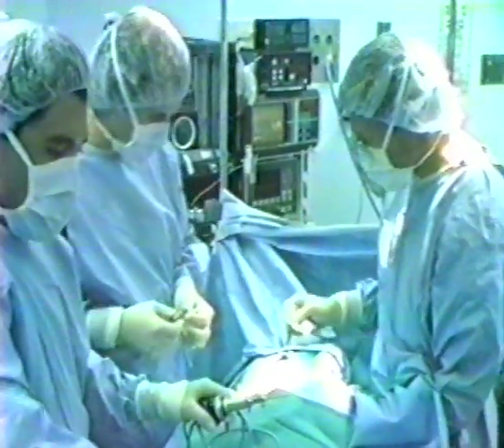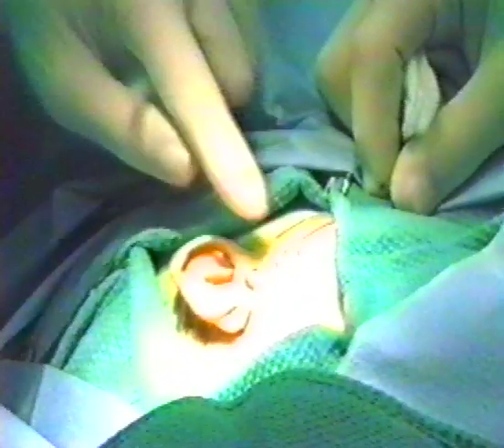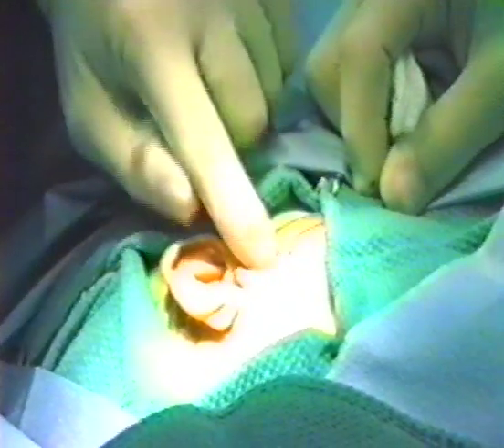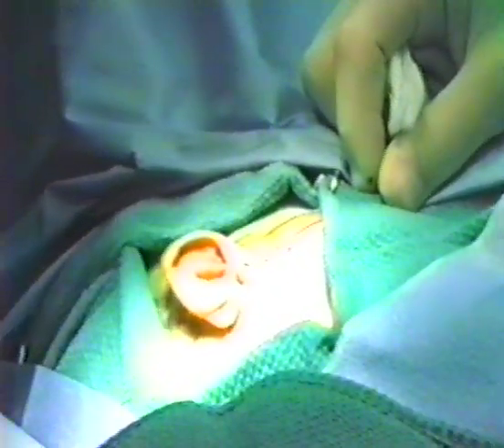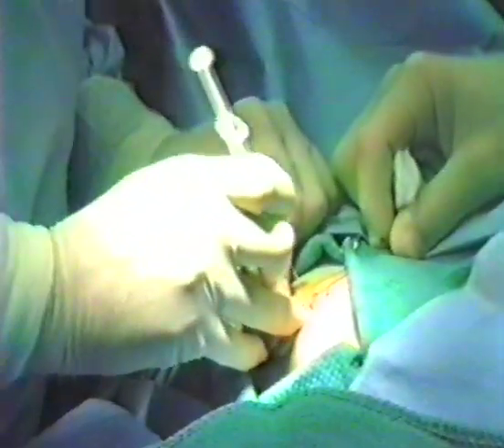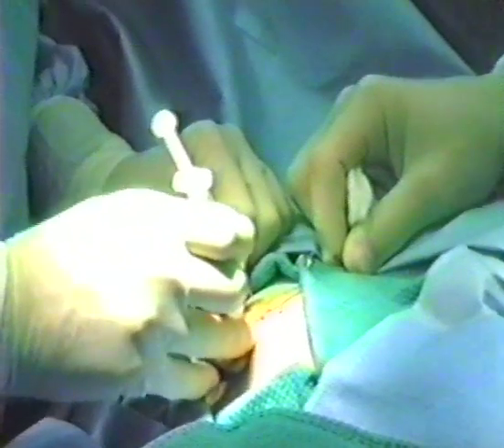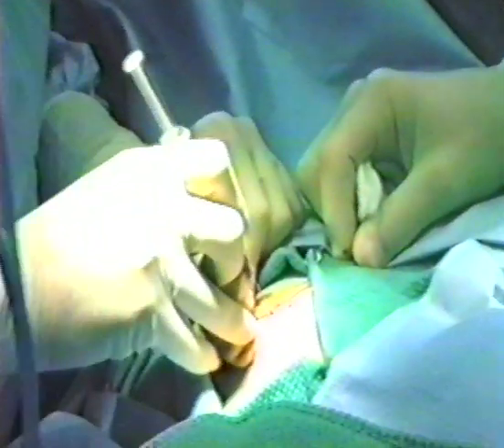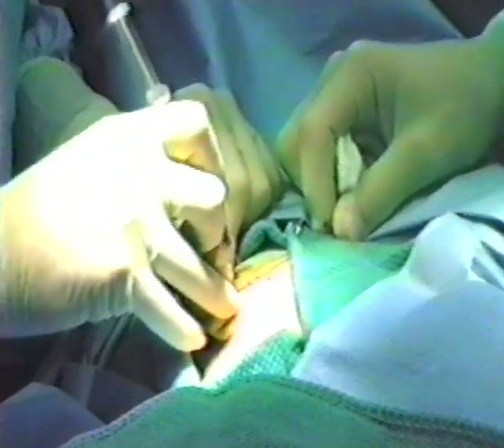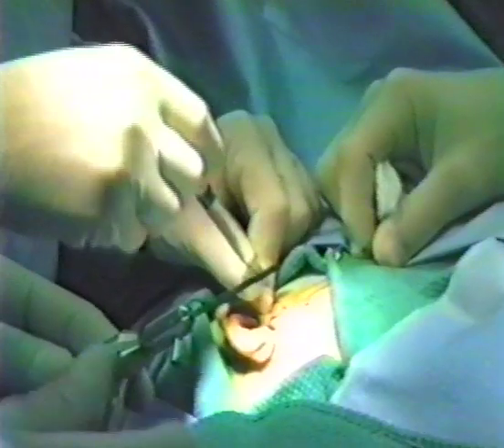In the United States, arthroscopy of the temporomandibular joint is traditionally performed under general anesthesia in a sterile setting. Using surface measurements and confirming these with palpation of the joint, the position of the superior joint space is identified. Since the superior joint space is only a potential space, additional room to accommodate the instrumentation is created by opening the mouth and insufflating the joint prior to the percutaneous introduction of a trocar and cannula.